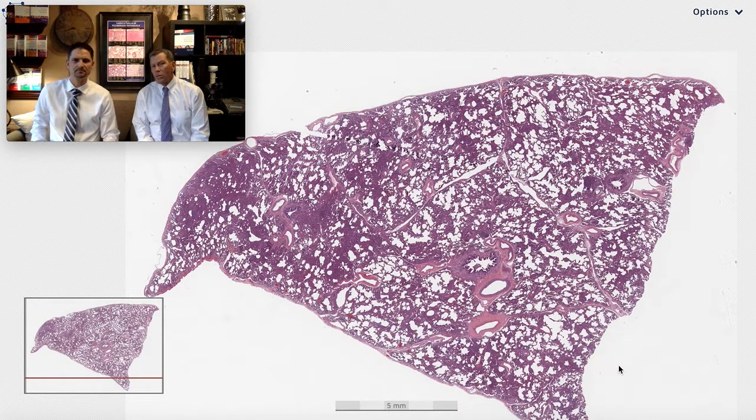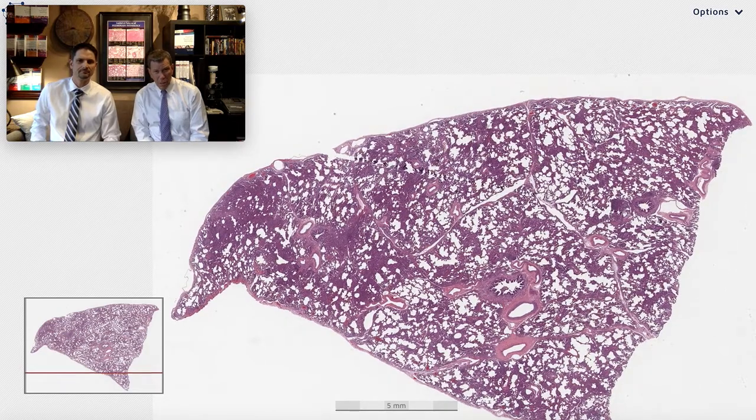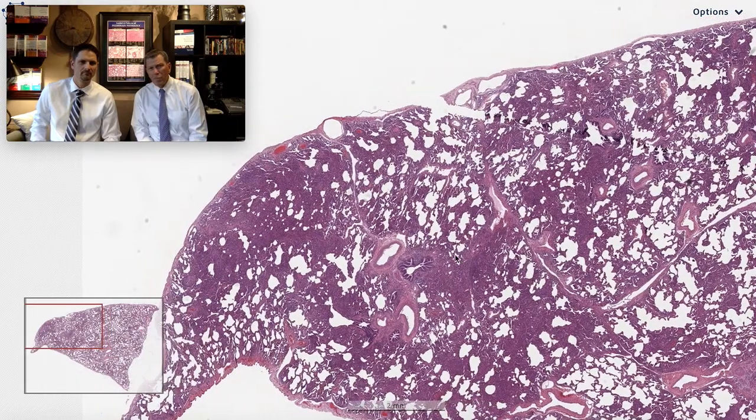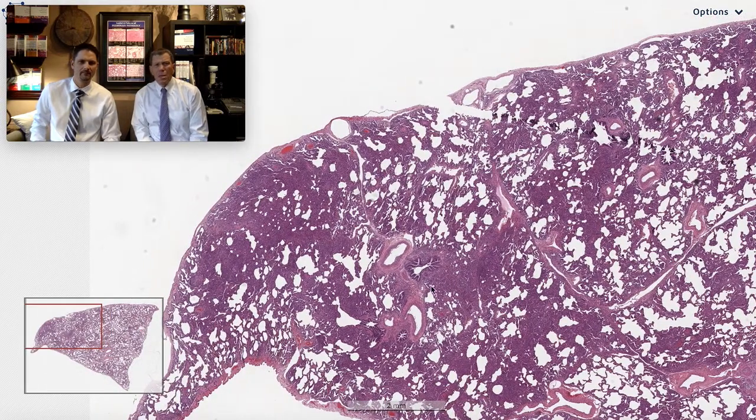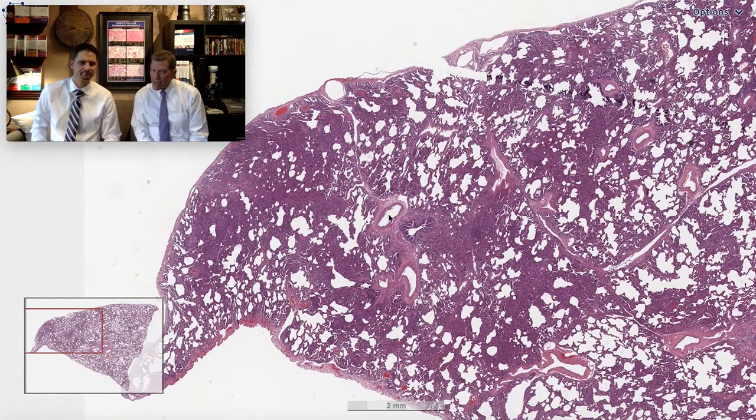And where are those? They look to be, at least, next to a bronchiole. And there's some arteries right in there. So there's a bronchiole that has a spin-off of blue around it right there. And it's not cuffing the arteries — you notice that? It's nodularity around the airway of blue cells.